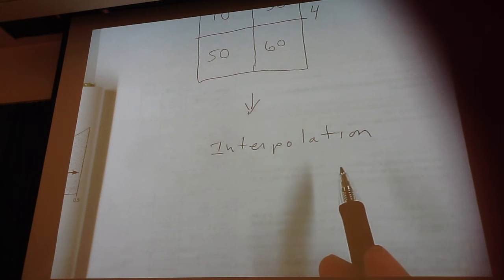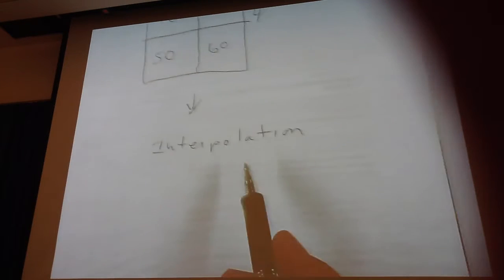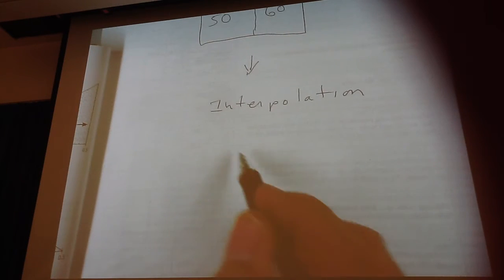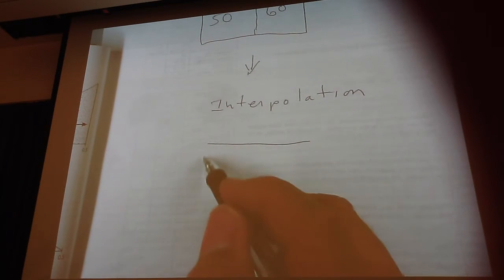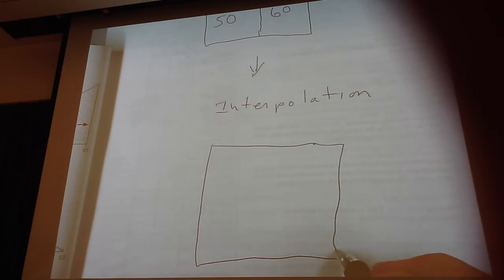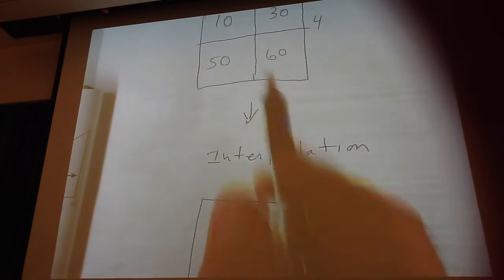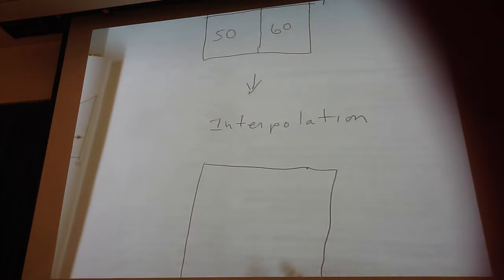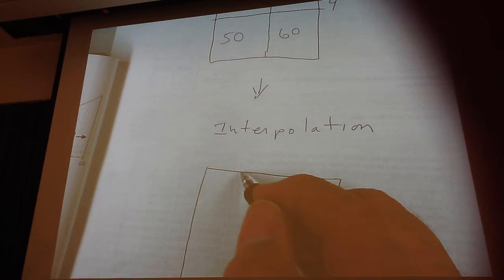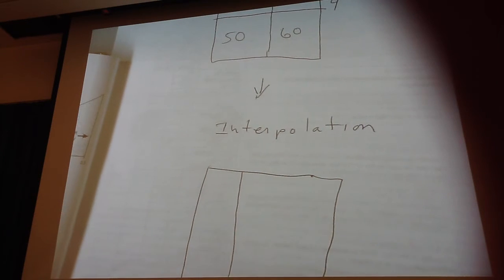We use it when we do plasma studies. Okay, but basically what we do is we artificially take our 2 by 2 matrix up here, and we're going to artificially expand it.